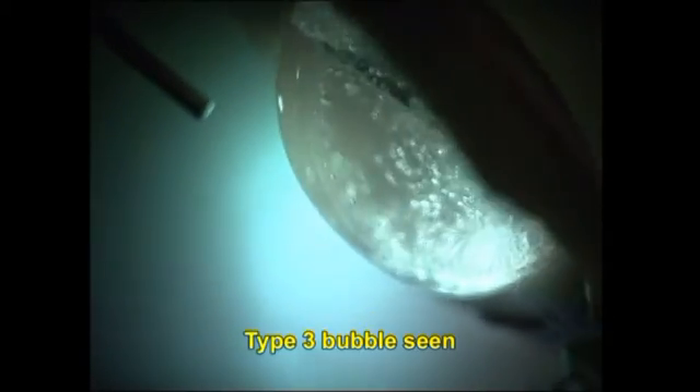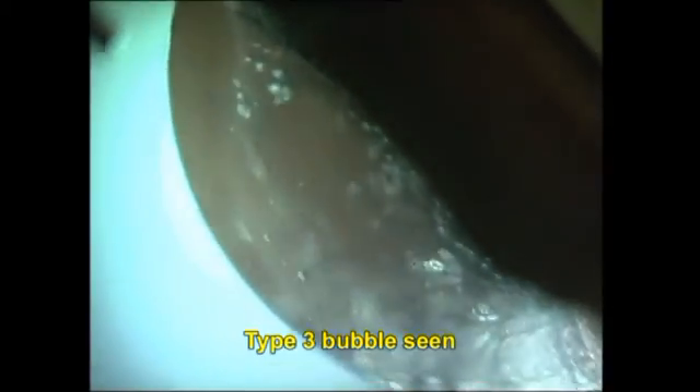Viewing the graft in profile with the endoilluminator light, you can clearly see the type 3 bubble — that is, a type 1 big bubble inside, covered by the type 2 on the outer side.